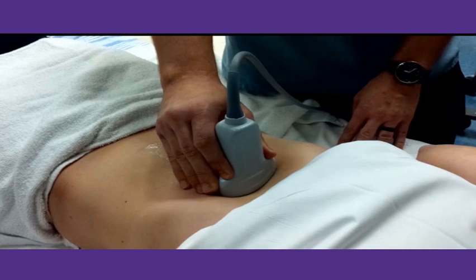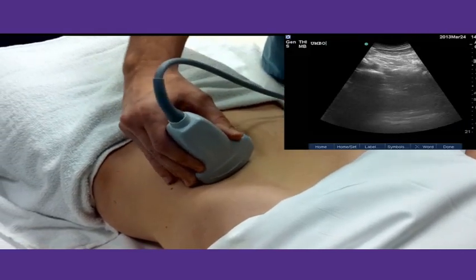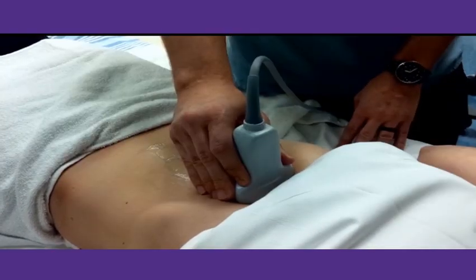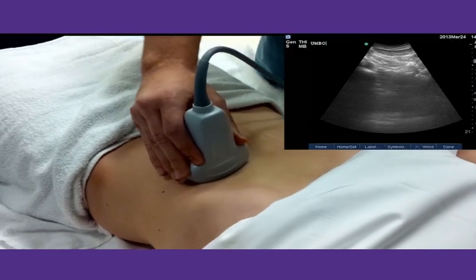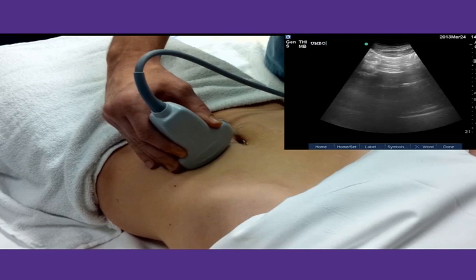The second option is to orient your probe in such a way that you get a glimpse under the umbilicus from its lateral aspect, as is shown here in this clip. It is important to visualize your area of interest prior to performing this maneuver and keeping it in view at all times. This ensures that you are always following the right vessel as you change your plane of scanning.